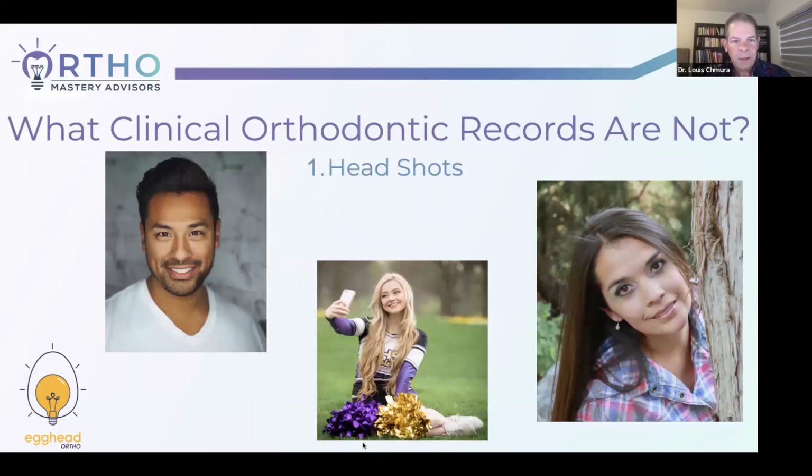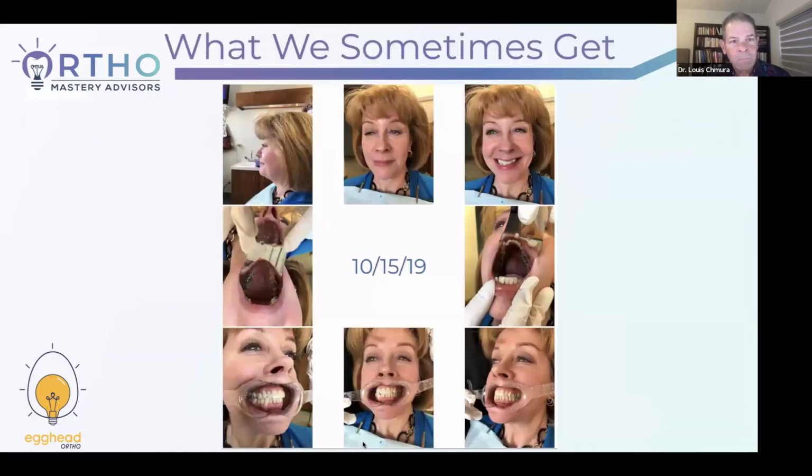So what are they not? They're not headshots like on the left. They're not the shots that you'd use to promote your business. They're not selfies, and they're not glamour shots that you would do for, I don't know, your high school graduation pictures. These are really clinical photos that are designed to show certain types of anatomy.